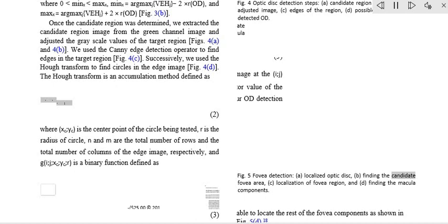Regional features of ISNT quadrants. The ISNT quadrant features represent the vessel structure of a retinal image in the 4 ISNT regions [19]. The vessel information at each region is represented by shape descriptors. Hence, we extracted localized shape properties of vessel distribution in a retinal image with the help of these features.